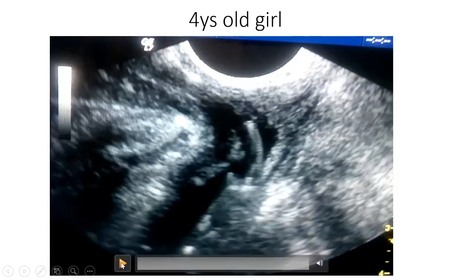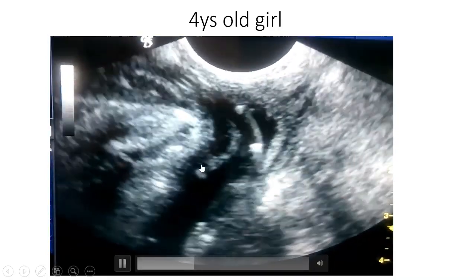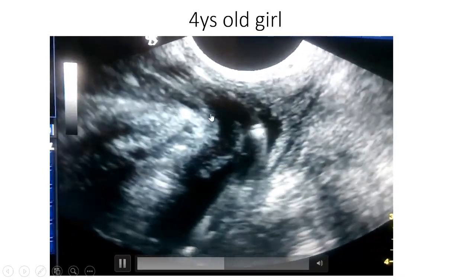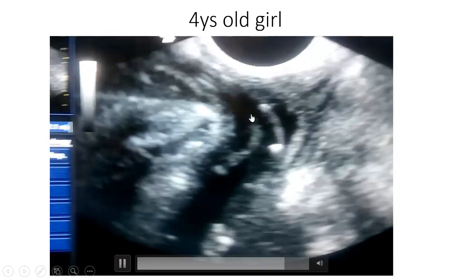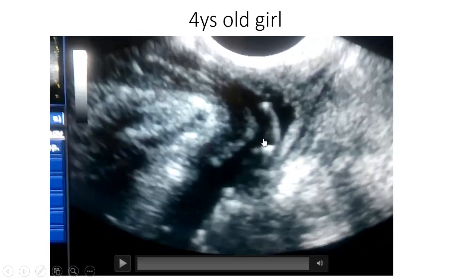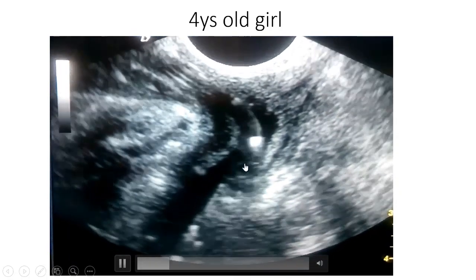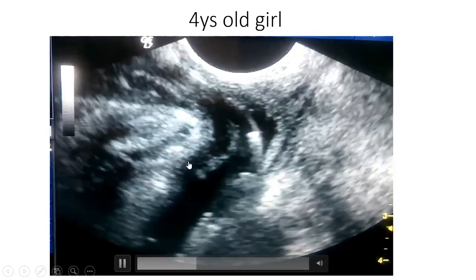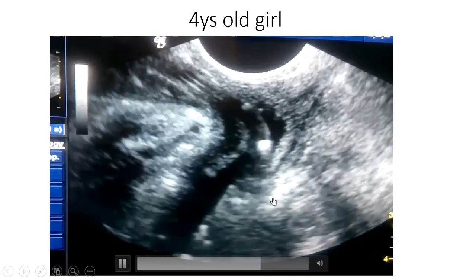This is also a case, a young female, 4 years old, and they used to send her to us in order to see the distance of the confluence between the urethra and the vagina. Nicely seen. I put here a catheter and inject saline, and we nicely see the confluence between the vagina and the urethra by a single common opening on the perineum.